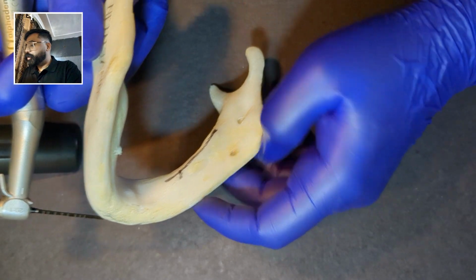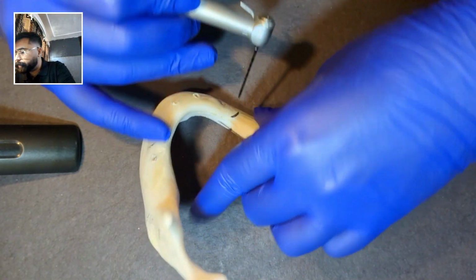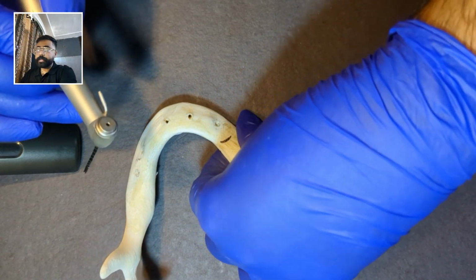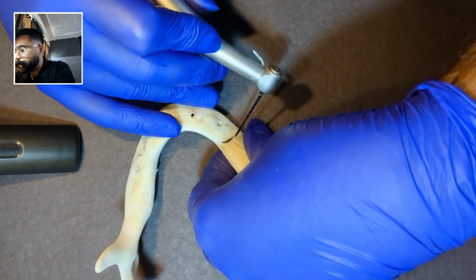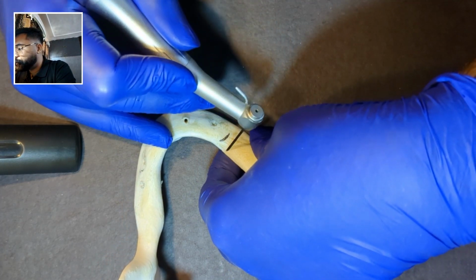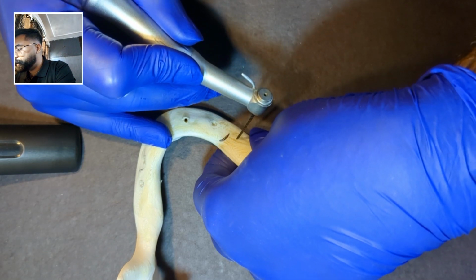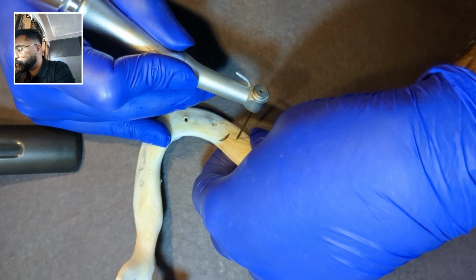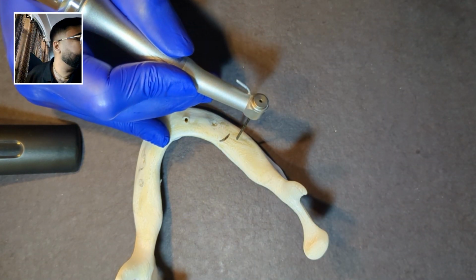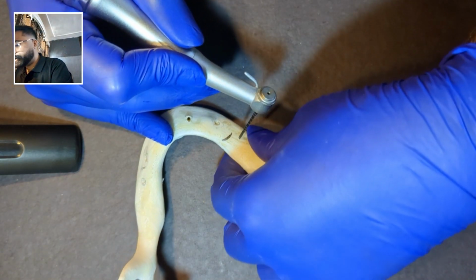So what we'll be doing is we will start the osteotomy from the buccal side. We will first place the finger on the lingual side just below the mylohyoid ridge, and then we will place our drill a few millimeters buccally from the crest, right? And we will aim the tip of the drill towards our finger. Let me increase the speed. The speed is now increased.